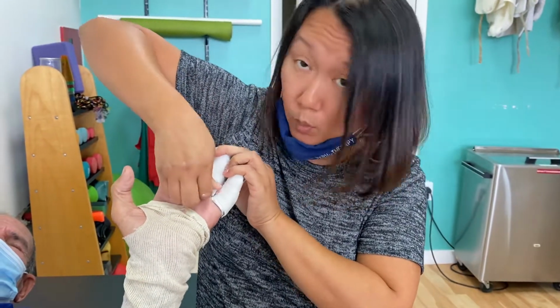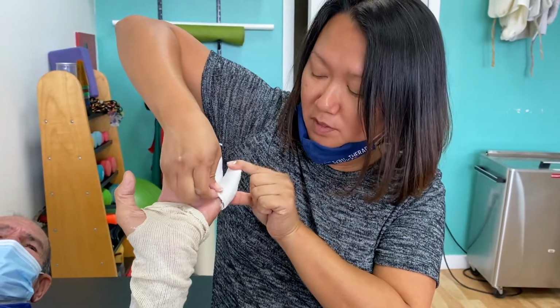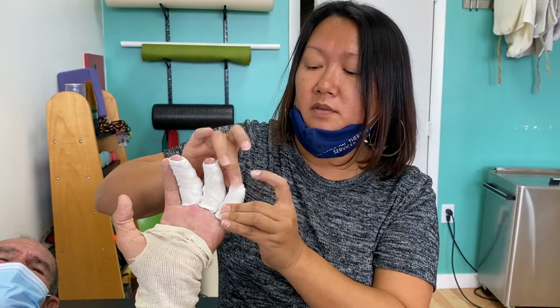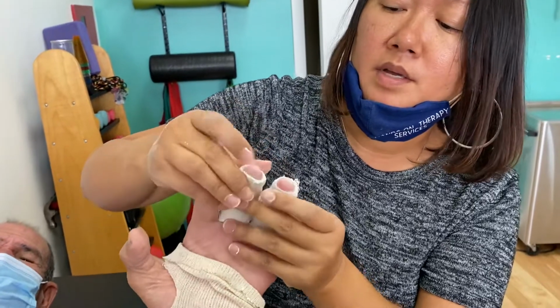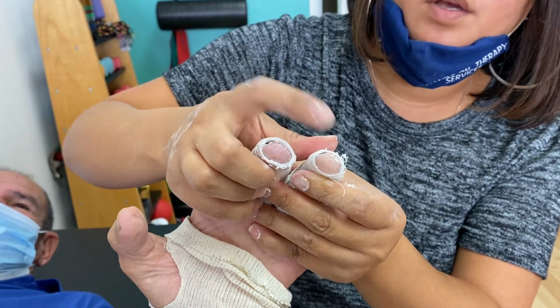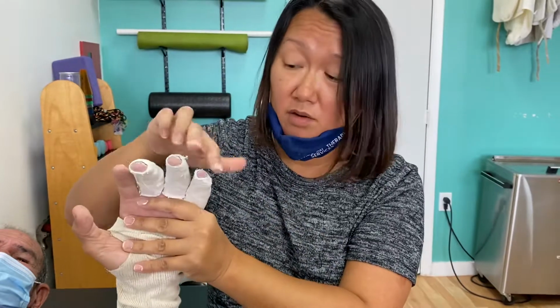That's okay. We're not redoing it. So I'm just grabbing my fingers and I'm going underneath. I'm just breaking up some of that. It's coming off tomorrow, so it's okay. The other thing is I left his fingertips open so I could see while he's here, is he losing any sensation? So you check for blanching. It goes white, it goes pink, goes white, it goes pink, goes white, and goes pink. He has numbness, so numbness might not be a great indicator for these two fingers. We can ask if he has more pain.